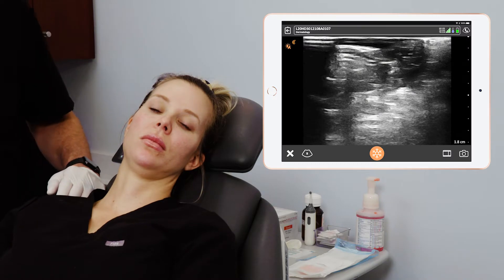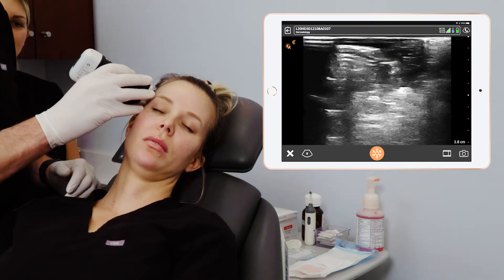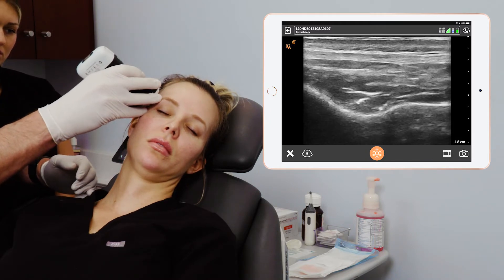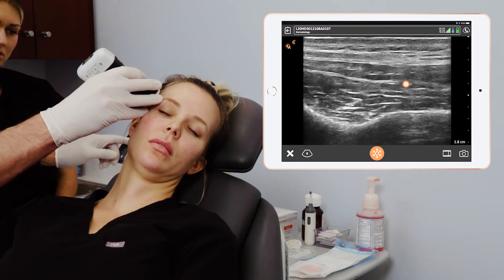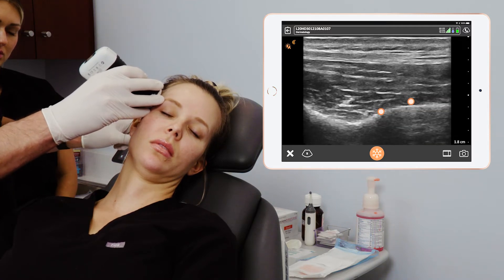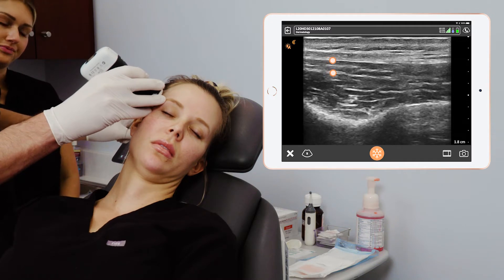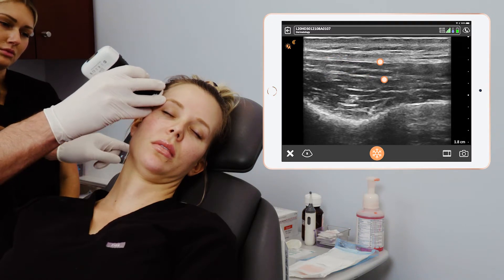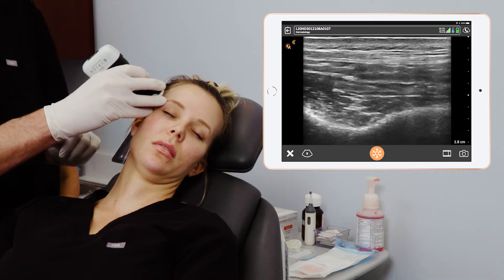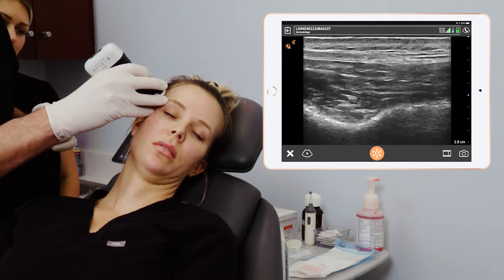We're going to look into the temporal anatomy and look for the vasculature. First, we'll look in B-mode at the temporal anatomy. What we can see here is the temporalis, the temporal bone, the intermediate temporal fat pad, the two layers of the deep temporal fascia, and the superficial temporal fascia or the SMAS. Our goal with this injection is to inject below the SMAS, above the superficial layer of the deep temporal fascia.